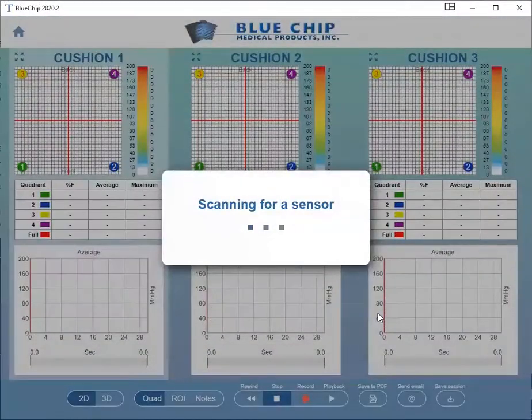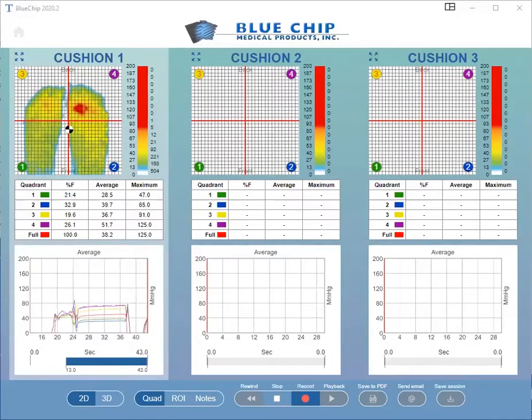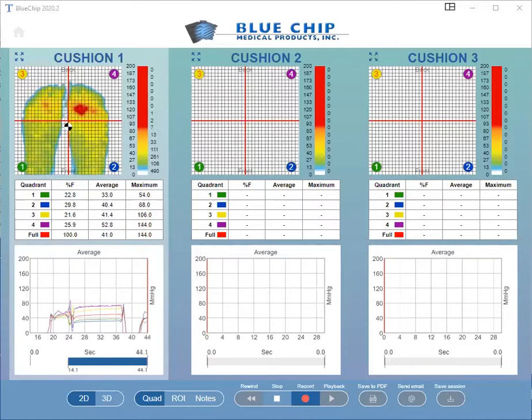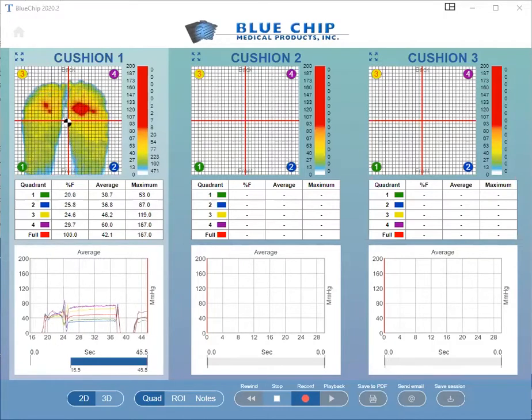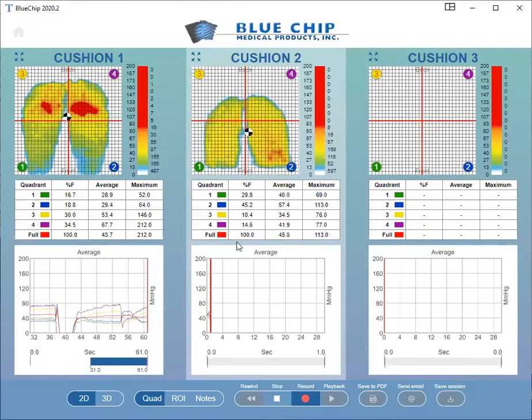Wait for the software to scan and connect to the sensor. Once connected, have the patient sit on the first cushion you wish to compare and click Record.